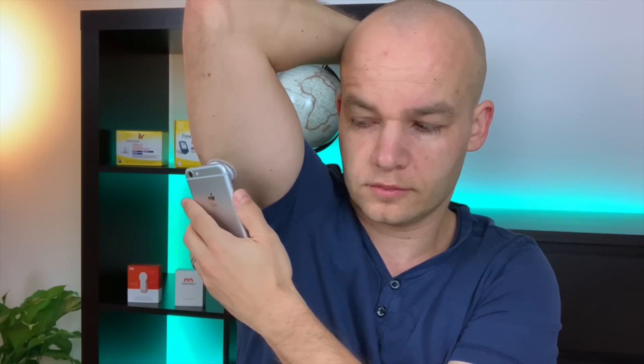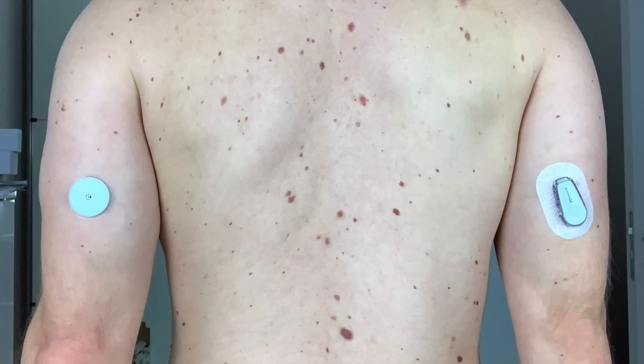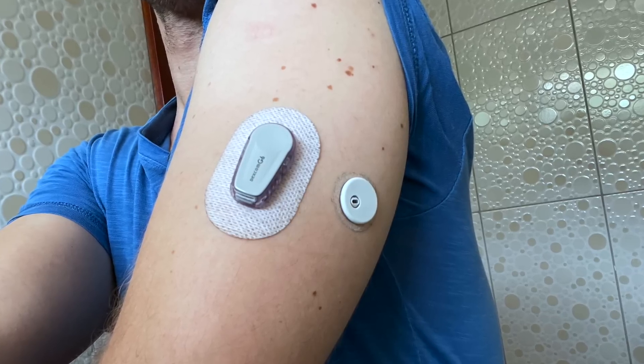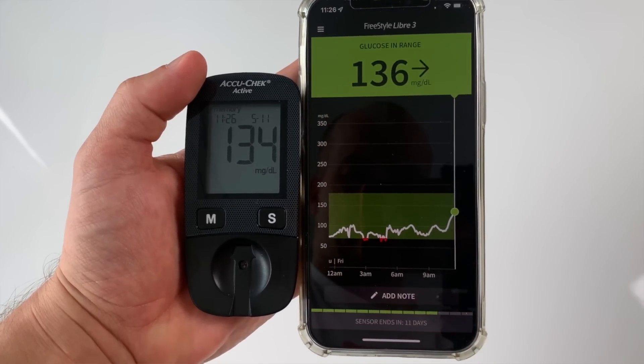I put the Freestyle Libre and Dexcom sensors to a real life test. In fact, I used at least one of them every day to monitor my blood sugar levels for the past four years. I tried Freestyle Libre 1, Libre 2, Libre 3, Dexcom G6, and I did a ton of research on Dexcom G7. There have been days when I had three sensors on running at the same time to capture as much data as possible.